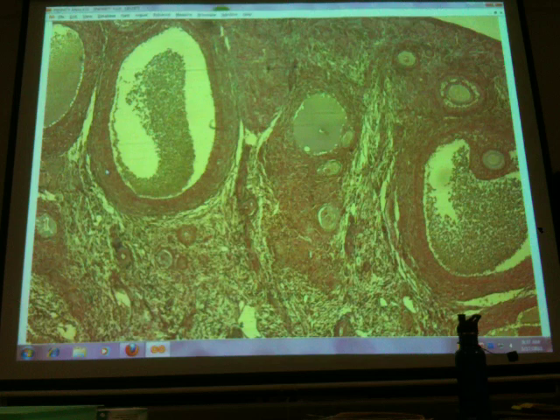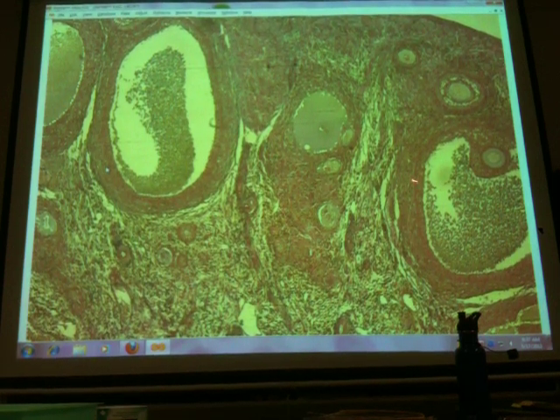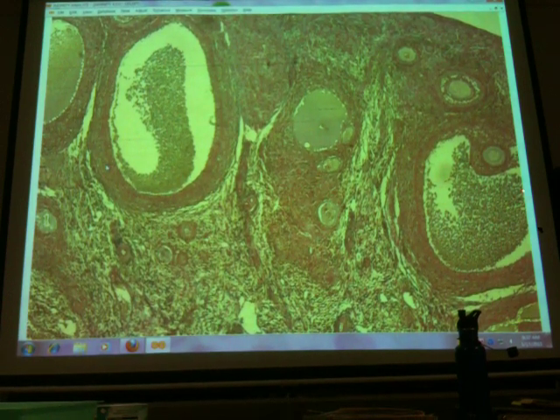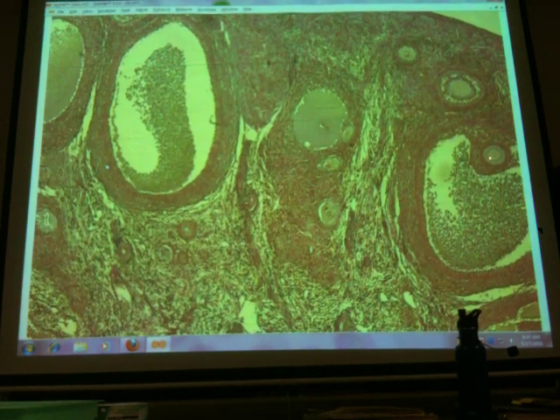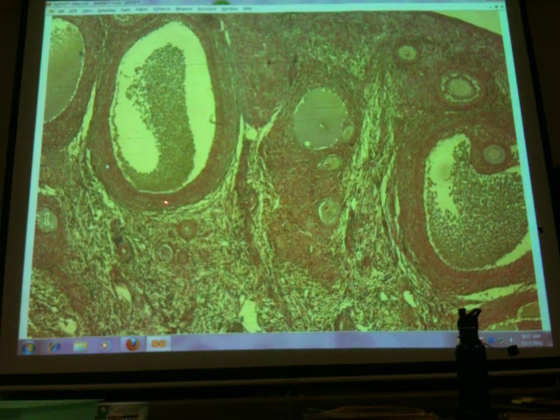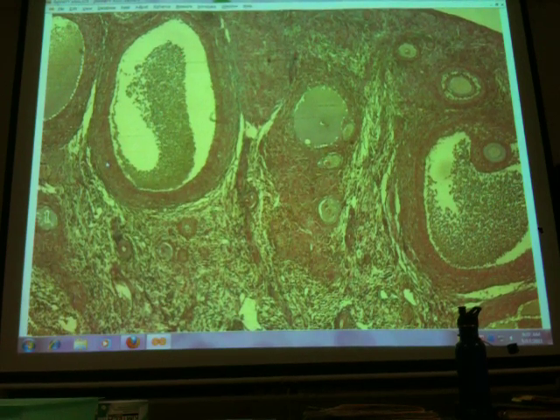Can you show the tertiary where that is again, please? This is a tertiary. This is the follicular fluid filling a space. This is the oocyte. This is a tertiary follicle that has not intersected the three-dimensional region where the oocyte is located.